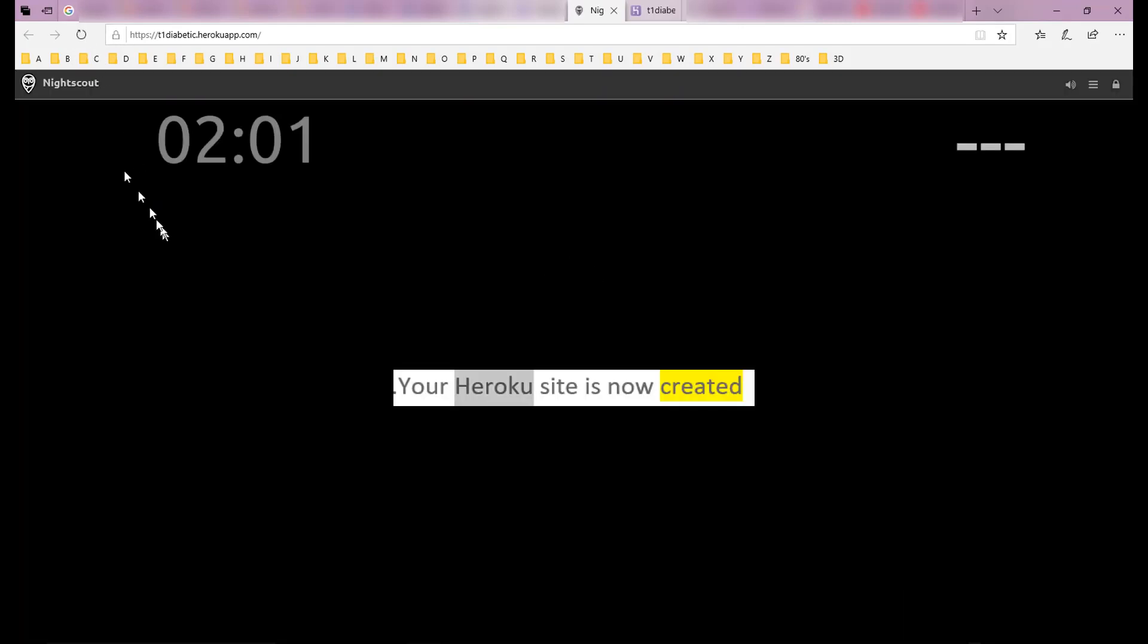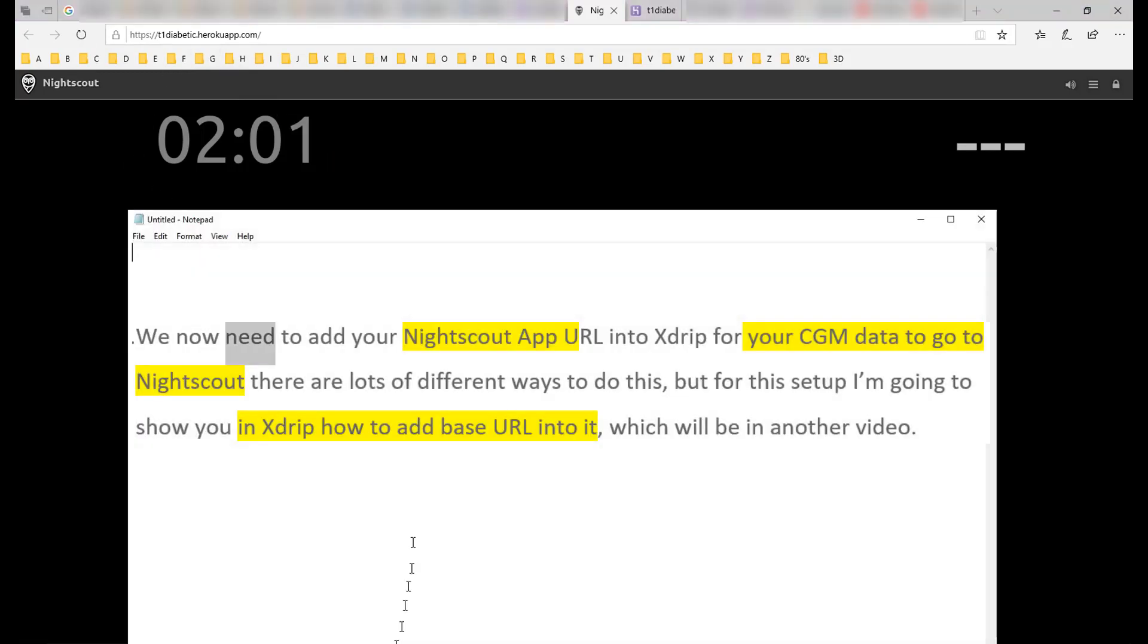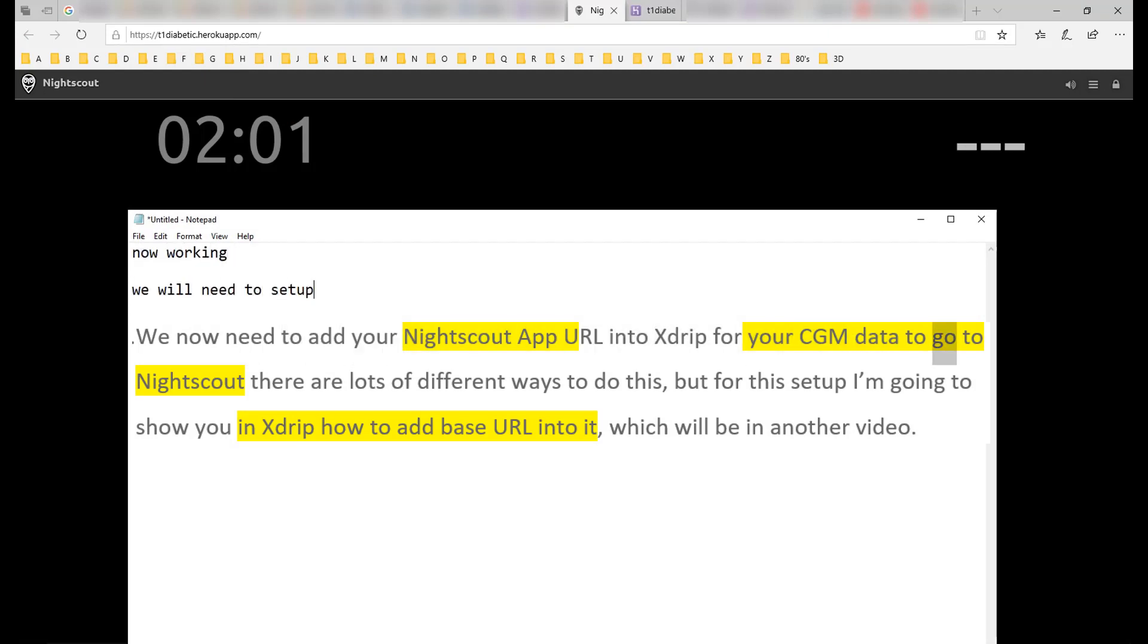Your Heroku site is now created. Make sure to write your Nightscout app URL down for safekeeping as we'll need this. We now need to add your Nightscout app URL into xDrip for your CGM data to go to Nightscout. There are lots of different ways to do this.